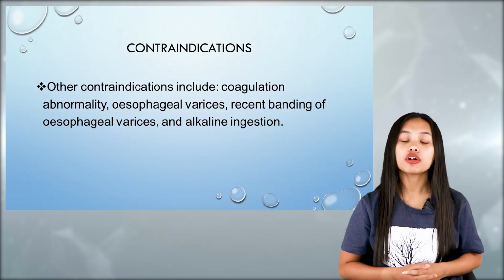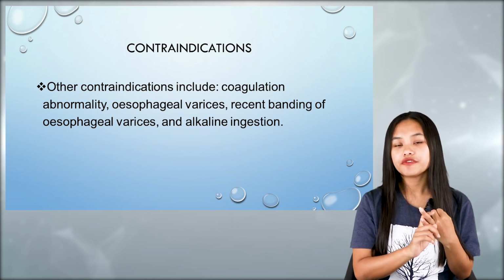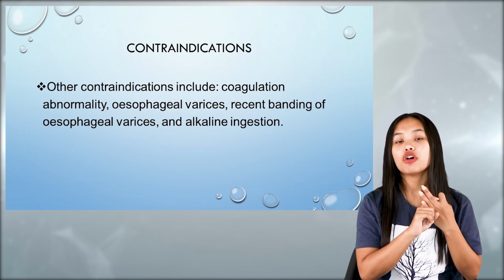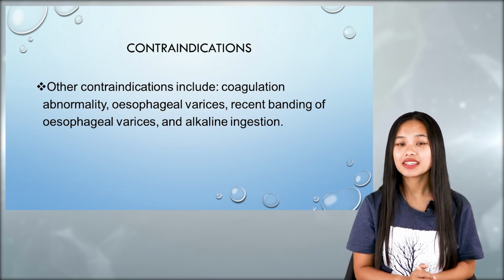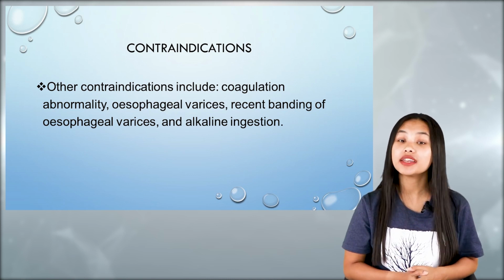So if the client had any recent nasal surgery or if there is a severe mid-face trauma, then insertion of this nasogastric intubation is contraindicated. It is also contraindicated in cases of coagulation abnormality, of esophageal varices, of alkaline ingestion, as well as of recent banding of esophageal varices. So if the patient is under these conditions, then this insertion of nasogastric intubation is contraindicated.